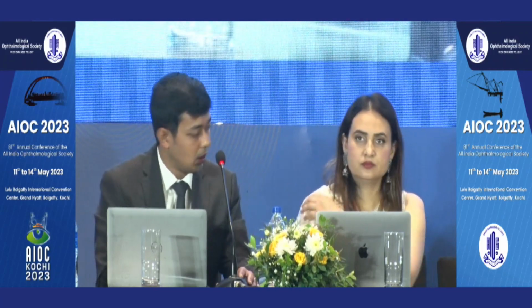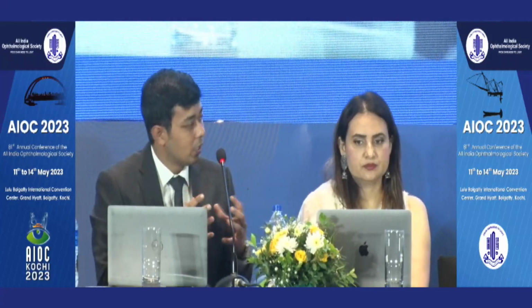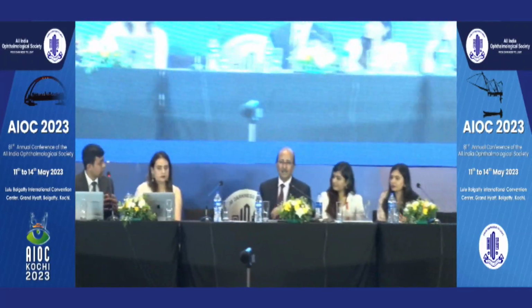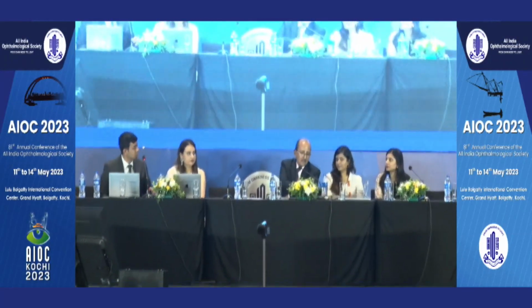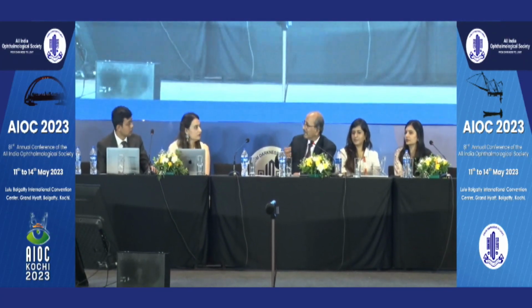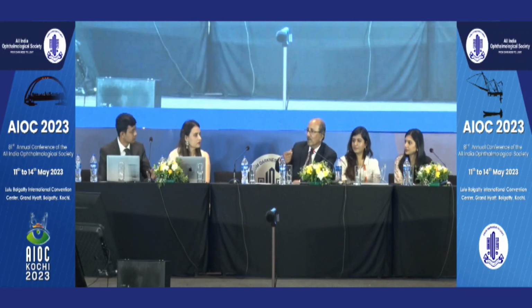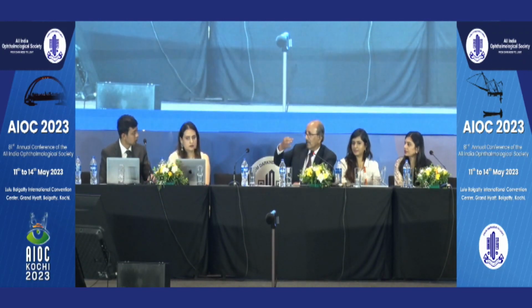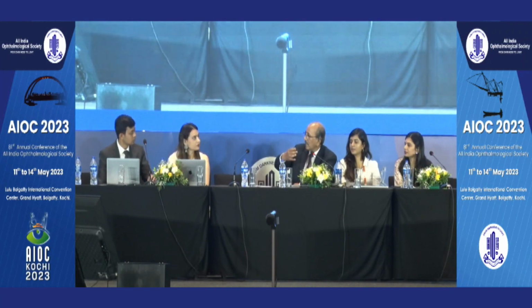While using the Aura, I know it's an expensive device, but that apart, how do you ensure that the amount of viscoelastic which is filled in the eye is comparable to the physiological IOP and we don't overinflate and underestimate the IOL power? If it is a low pressure, it will not even detect it. So it has to be adequately filled, and then if it comes low, you have to adjust, and if it still comes low, you can inject more.